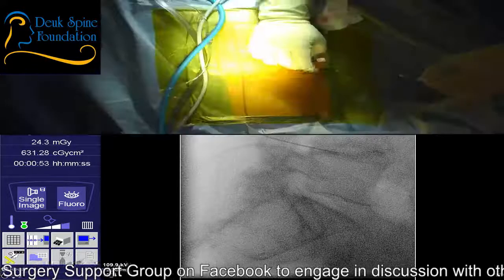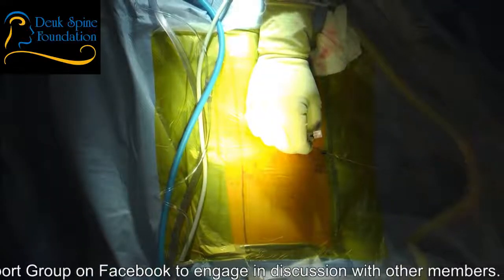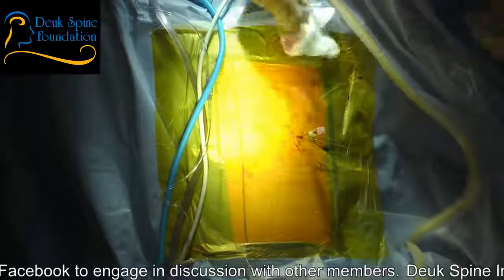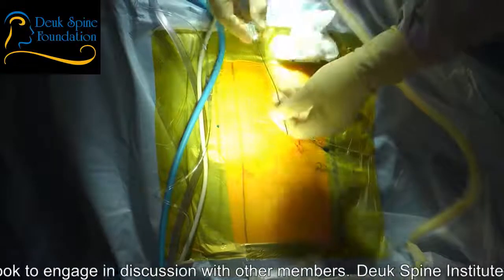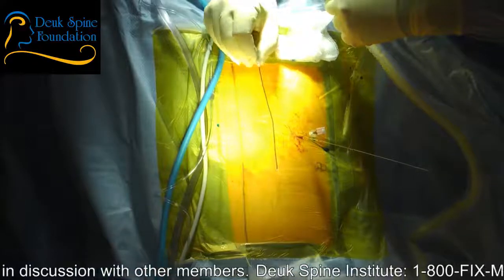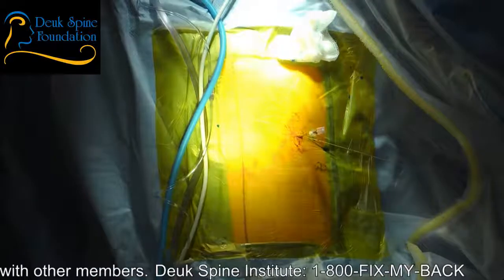Now, why would the needle be bent? Well, the needle would be bent because I have to apply force to the needle to get it past all these hard bone spurs. And this is a perfect example of that right here. Can you all see this? Yes, we can. Can you see that the needle is bent? Yes. Yeah, so it bent a little bit while I was trying to get it in.